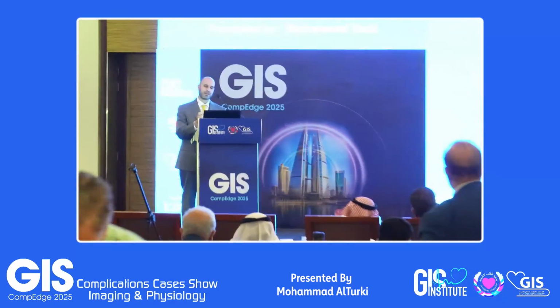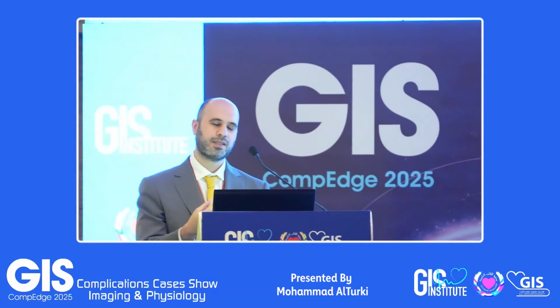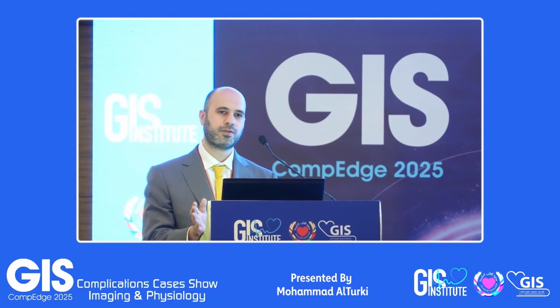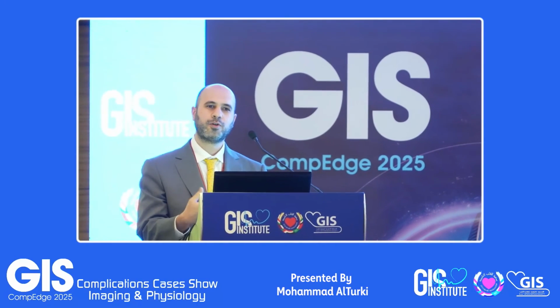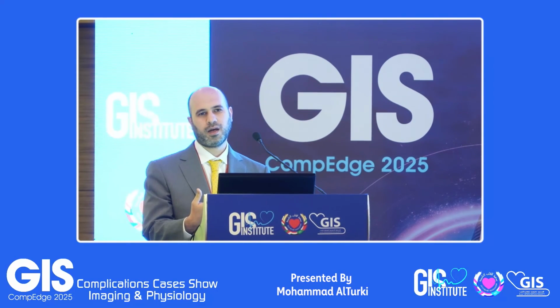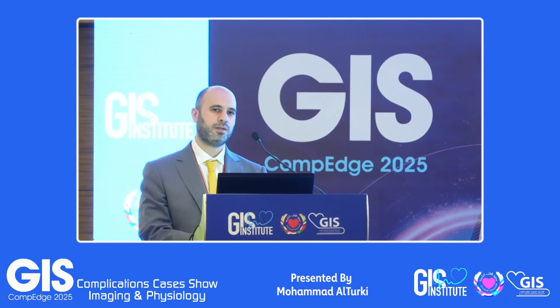As I said, I think the OCT catheter, when trying to advance it into the LAD, was prolapsing into the LCX. Sorry, I don't have any fluoroscopic images of this. The LCX was normal to start with. I think this caused the iatrogenic dissection. The thing that pushes you to intervene is that the patient is having chest pain. I think this pushes you to intervene and not wait and give it more time to heal. The amount of interaction you got is great, a great case.